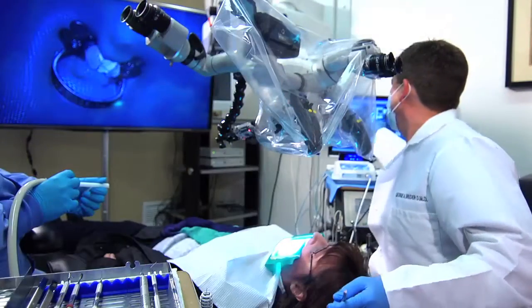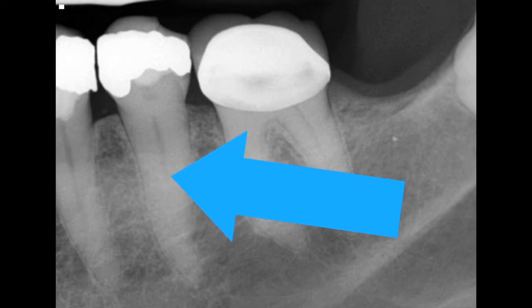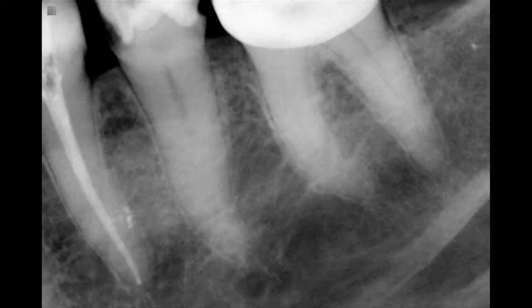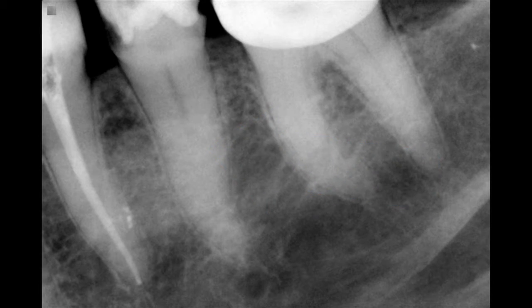case. This is a good TRUShape case because these teeth are traditionally wider buccal lingually, so the three-dimensional morphology is not conical. It's wider, more elliptical. And so if we address this as two different systems, this allows the file to conform to the natural morphology of the tooth, which obviously will make more contact with the canal walls.